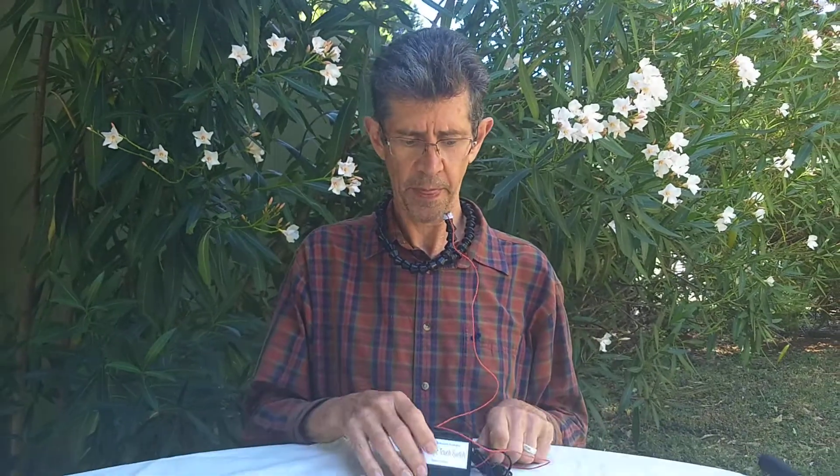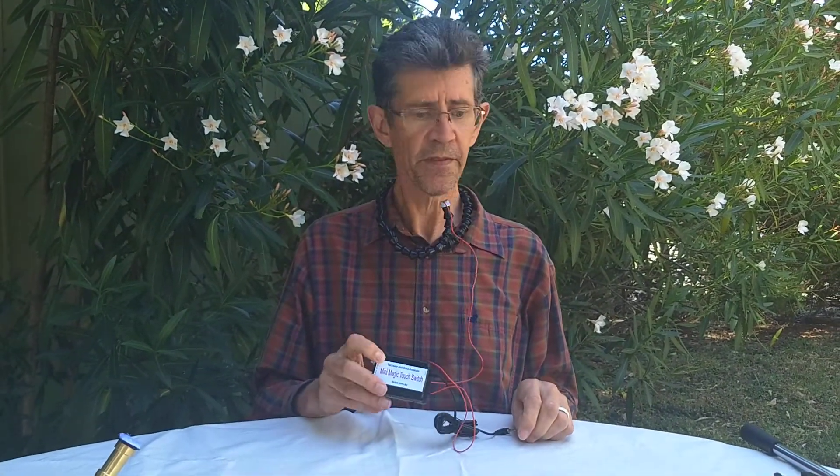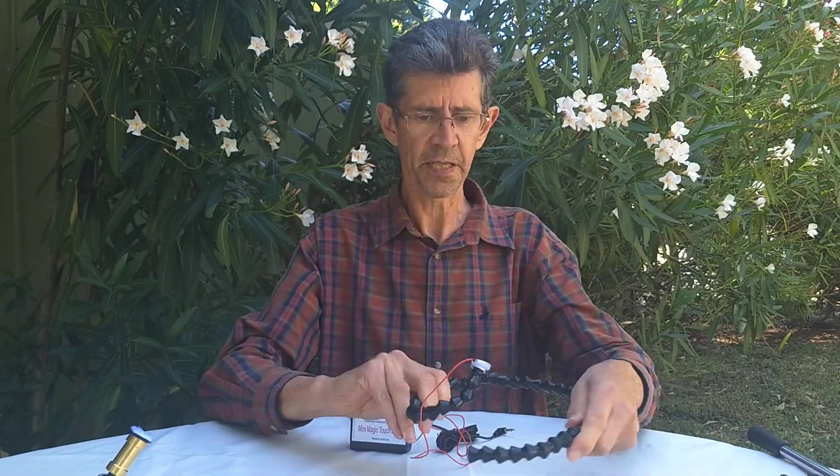If I turn around and activate it — no hands, no other mounting paraphernalia around me. It's quite neat and tidy and very effective. So that's the flexible neck mount.